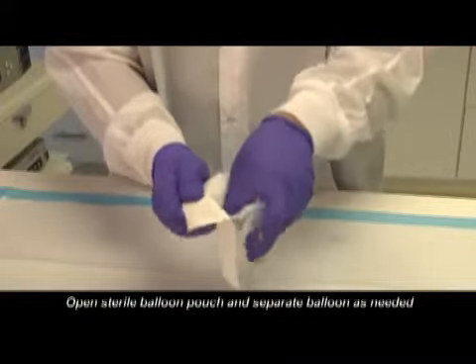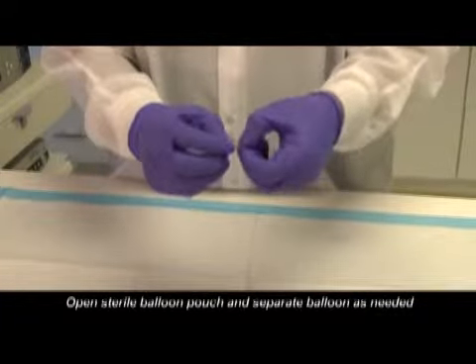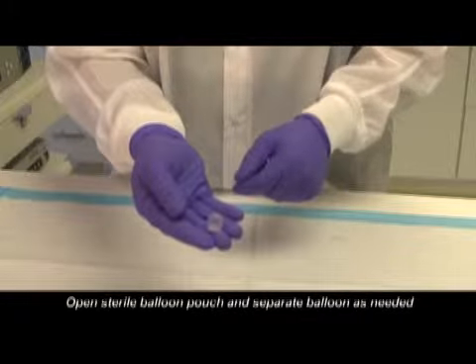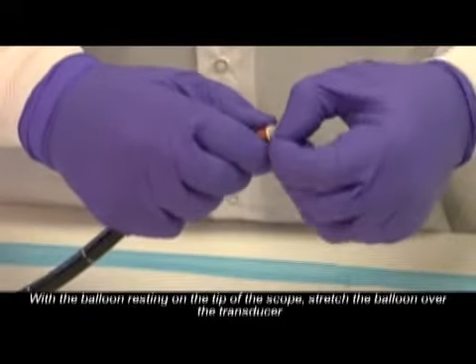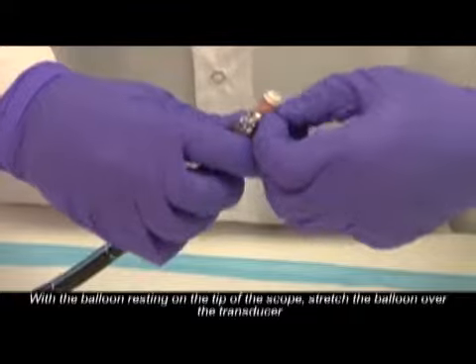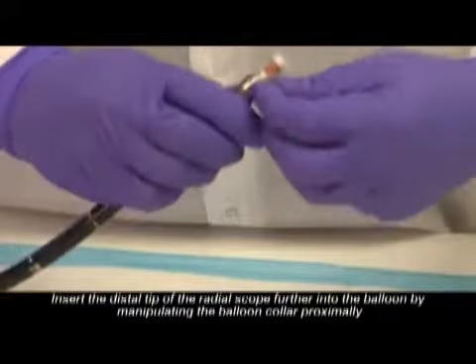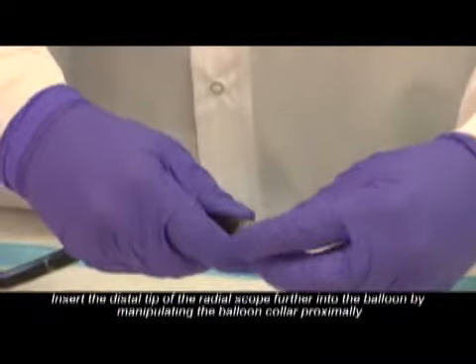Open the sterile balloon pouch and separate the balloon as needed. With the balloon resting on the tip of the scope, stretch the balloon over the transducer. Insert the distal tip of the radial scope further into the balloon by manipulating the balloon collar proximally.